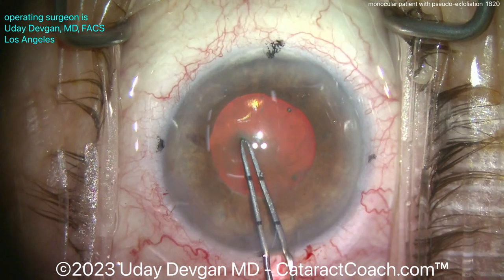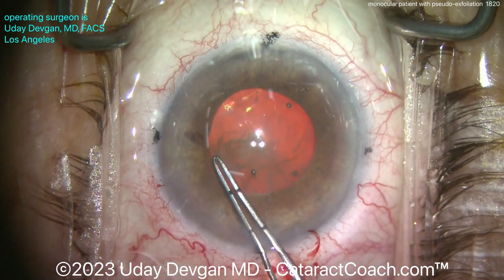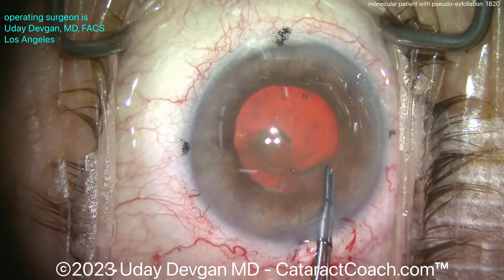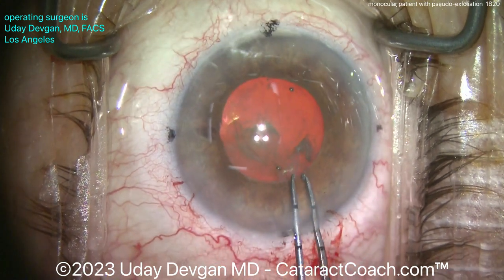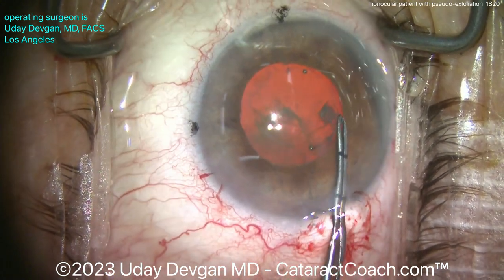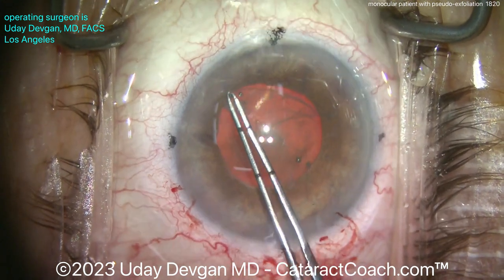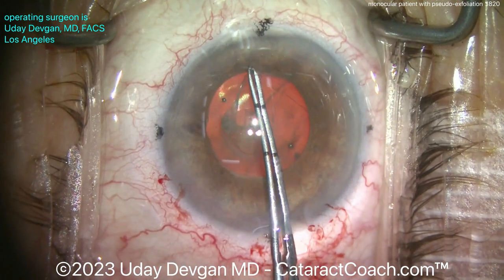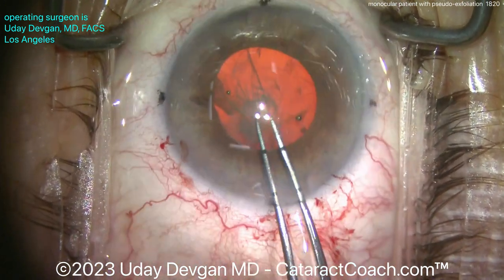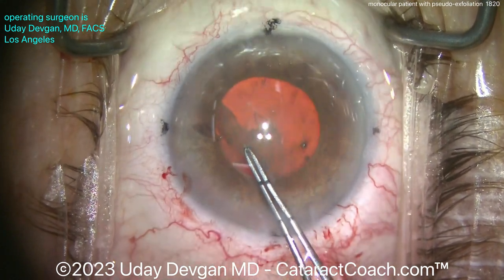We want to make this rhexis right up against that pupil margin — we don't want a small baby rhexis here. Remember with pseudoexfoliation the patient has a higher tendency for capsule contraction, phimosis, etc. So getting this rhexis done very carefully up against the pupil margin, we want about a five and a quarter, maybe five and a half millimeter diameter capsulorhexis. It's coming out pretty nicely at this point.